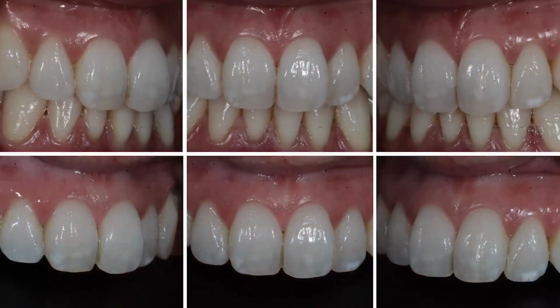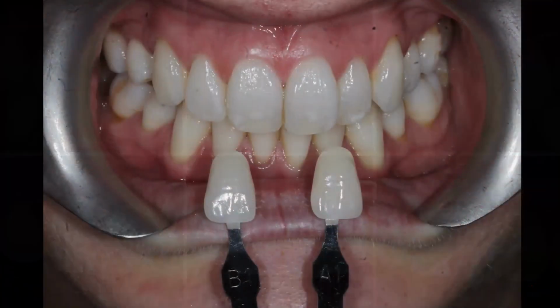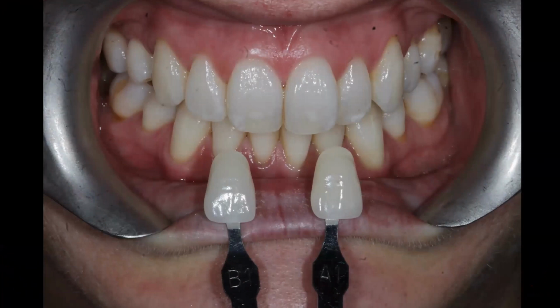And so the close-ups here, you can see the outlines of these on a few of the teeth. I'd say the centrals and the laterals are what are most affected by it. And so that's what we want to treat here. Interestingly, her teeth were quite white already. She had whitened in the past, and you can see here in terms of the B1, she's not really far off that shade already. And when asked further if she was happy with the color of her teeth or wanted to whiten, she said actually no, she doesn't want to.